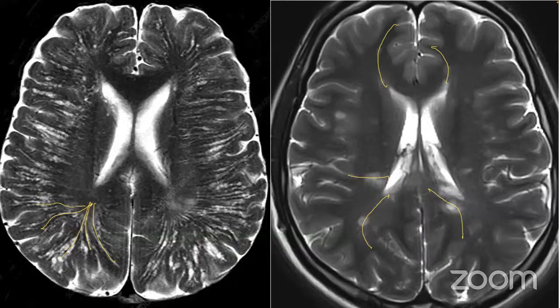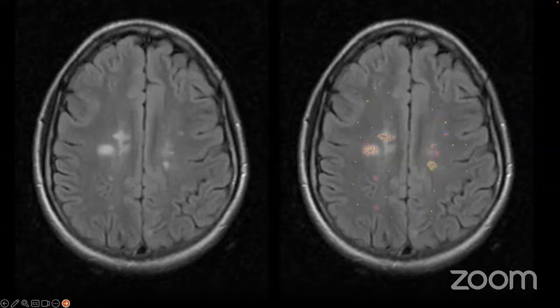So virtually all the focal lesions will follow one of the radial patterns that we can guess from the Virchow-Robin spaces. So on the left is just a person with markedly dilated Virchow-Robin spaces but does not have MS, and on the right is a patient with MS. Moving on, here's how I can imagine how an MS lesion appears.